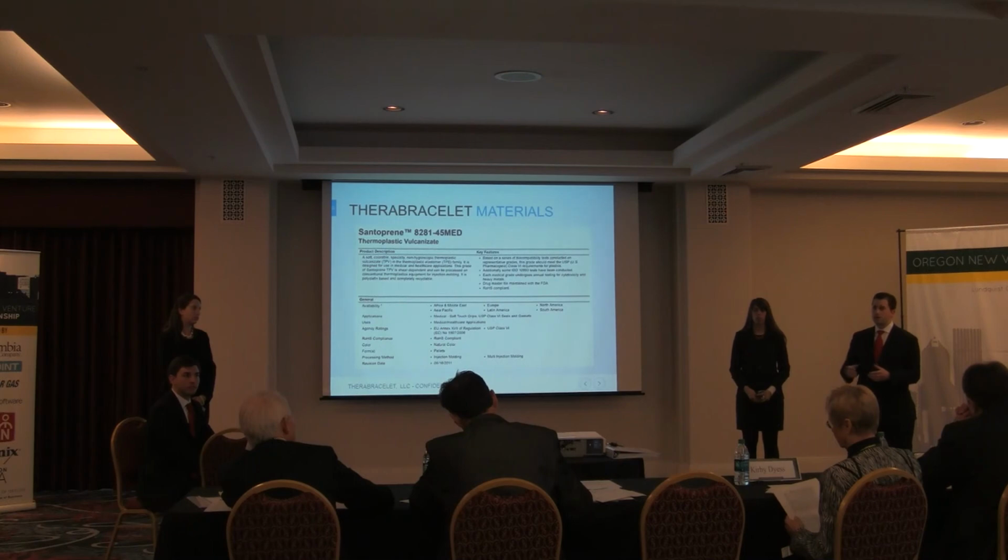When we built it, one of our main things for raw materials was finding raw materials that could be sourced from multiple providers so that we never got hung up waiting on a raw material, a component from some individual spec. So we're using very standard components. One of those would be a standard USB charging cable.